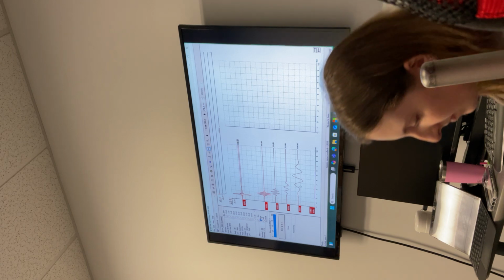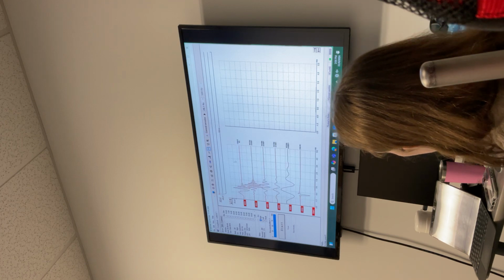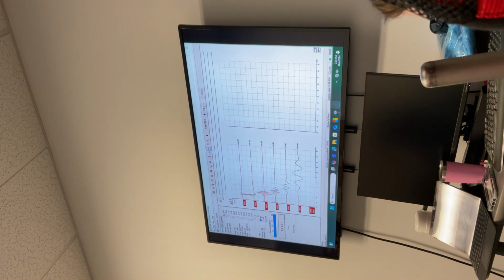500 hertz. Okay. So this is all clicks and tone burst. That's showing the rise and fall of the whole cycle, all 5 cycles. And it's taking much longer to go through the cycle, which is bad. The problem is if there is an abrupt onset here, then the stimulus is not frequency specific. Because if it is an abrupt onset, it will become like a click stimulus. It will have broad energy that defeats the purpose of doing tone burst ABR. With the tone burst ABR, you want to obtain frequency specific information.